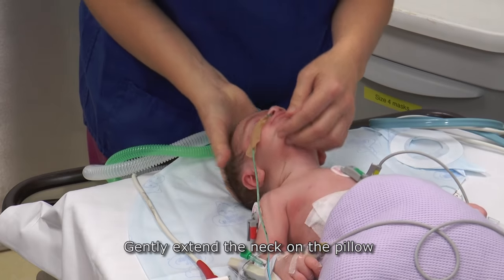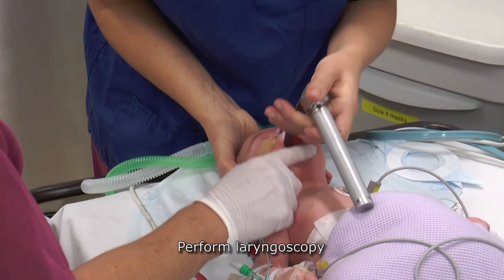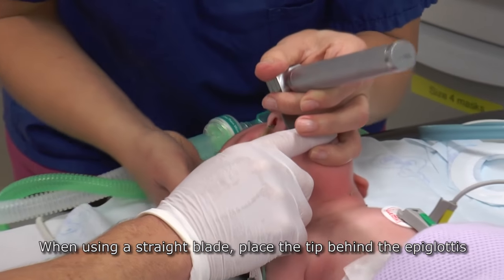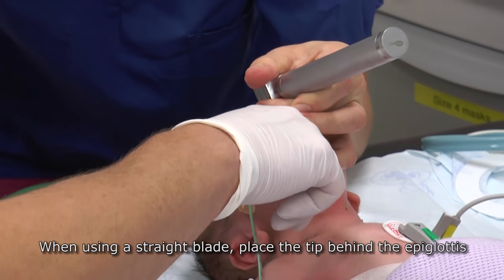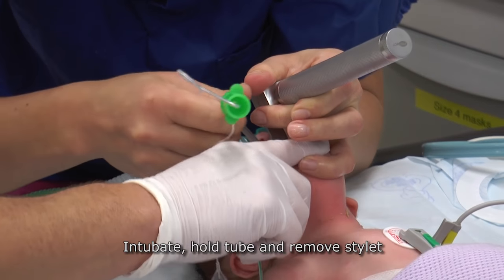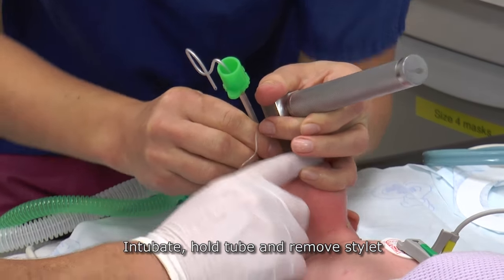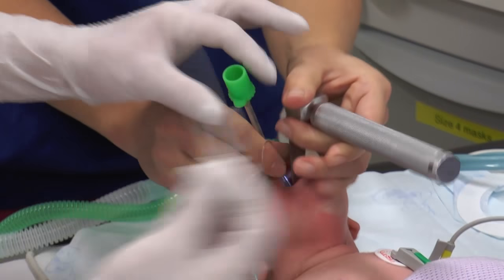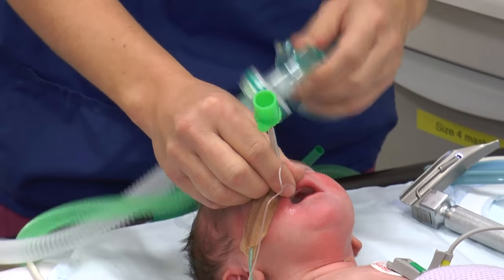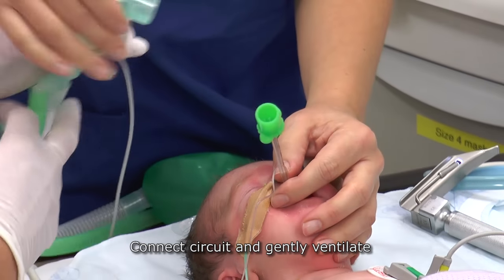Gently extend the neck on the pillow. Perform laryngoscopy. When using a straight blade, place the tip behind the epiglottis. Intubate, hold the tube, and remove the stylet. Connect the circuit and gently ventilate.